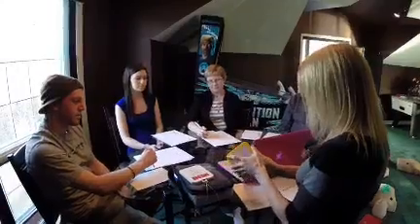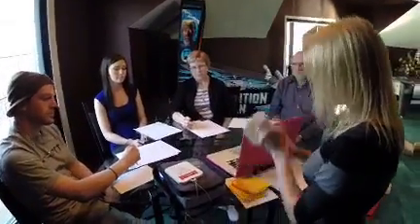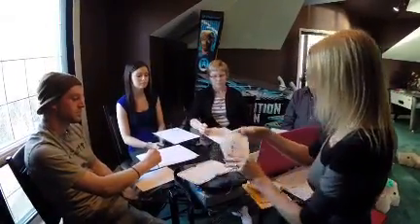So now, do you think you can use an AED on children and infants? Think so? Yes. They make children pads, and they look like this. All AED pads will have pictures on them to show you where to put them. So on a child, you're going to put one in the front and one in the back. So that's how it's going to shock the child. For an adult, pads, they have pictures as well. You're going to put one here, and you're going to put the other one here. Okay? And it goes across the body, and it shocks the heart.